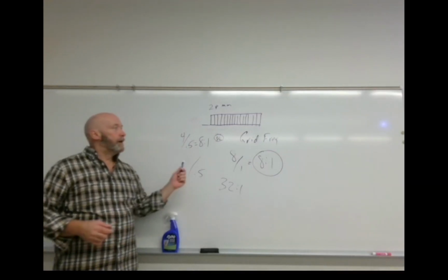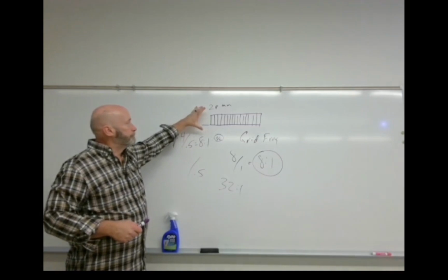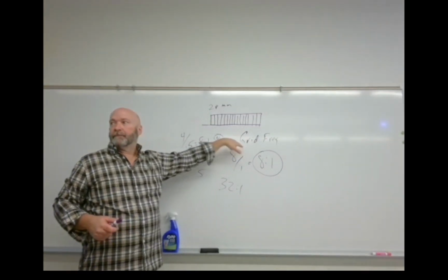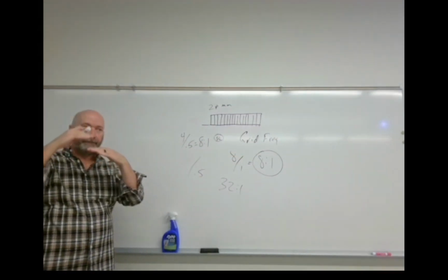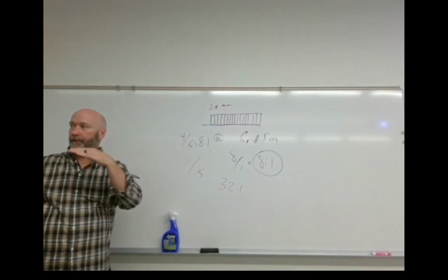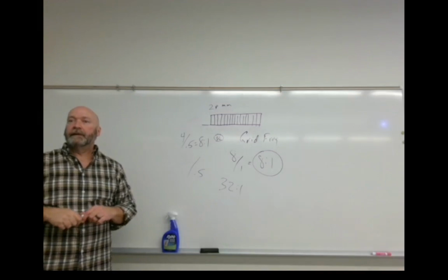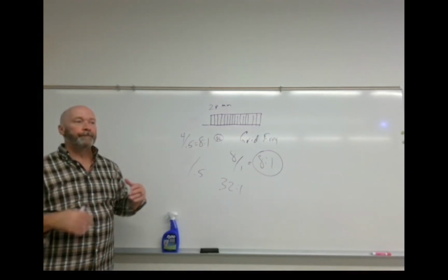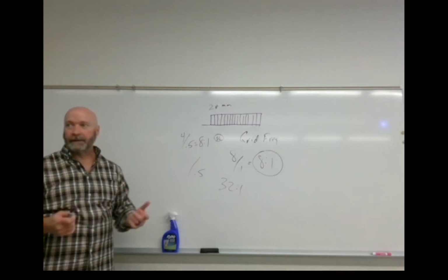All right, so what they did then is they took the grids and increased the grid frequency, maintaining the same grid ratio by decreasing the height of the grid and doubling the number of grid strips in between. Now the grid pattern and the scan pattern are not so much alike, and the aliasing artifact goes away.